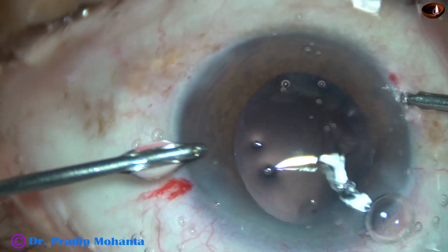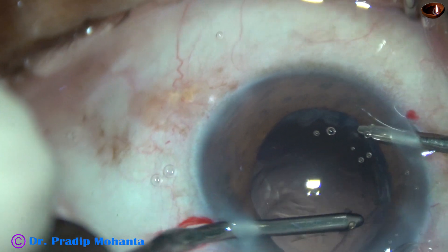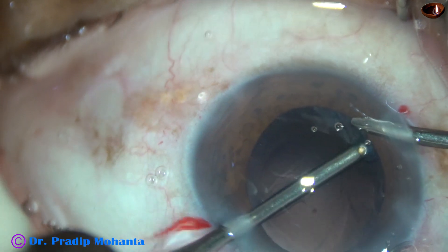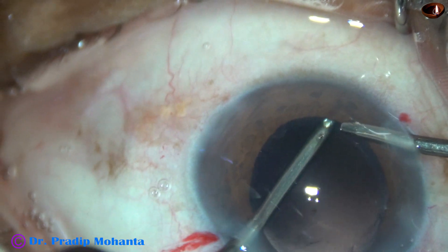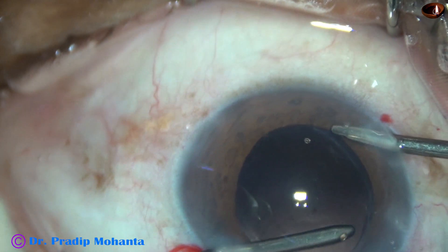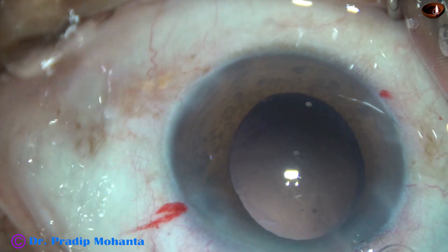And now I use bimanual irrigation aspiration to remove the cortical lens matter. At this time, the pull is always tangential and not centripetal. Centripetal pull will cause more stress on the zonular fibers. The cortical cleanup has been very nice in this case.